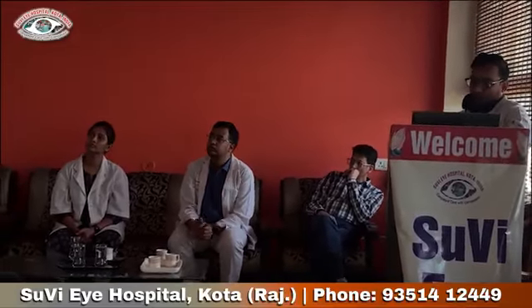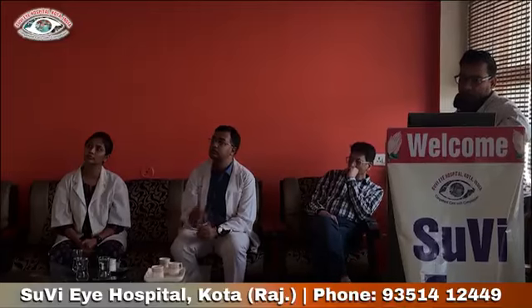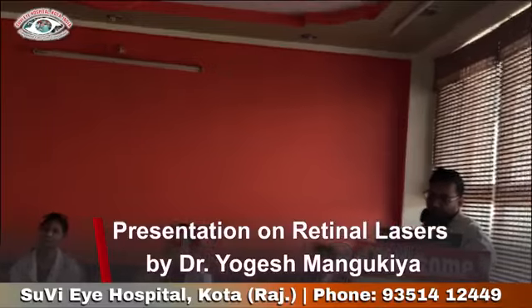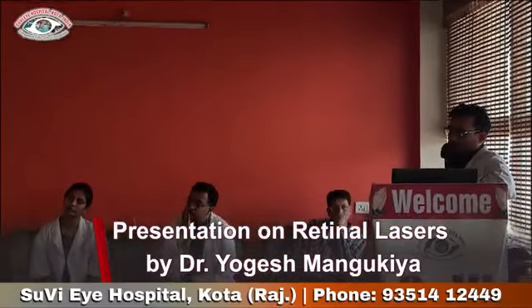When a patient comes, which lesions do we have to laser? Any lattice with tractional holes or breaks within it, symptomatic lattice degeneration, with symptoms usually like flashes and floaters. If the patient has a history of contralateral retinal detachment, or is undergoing surgery like refractive surgery or cataract surgery.